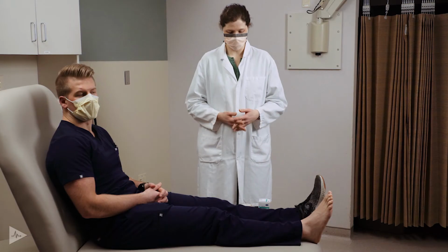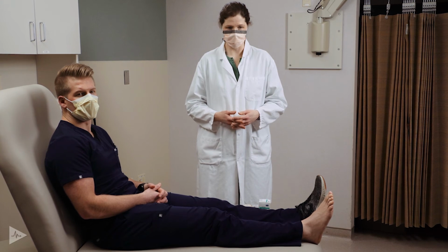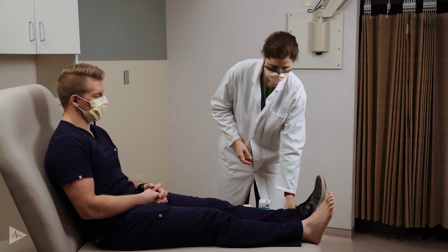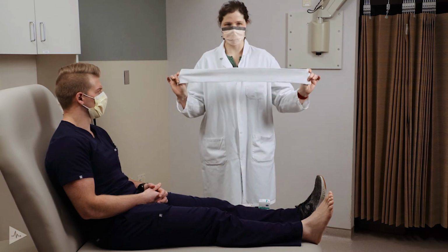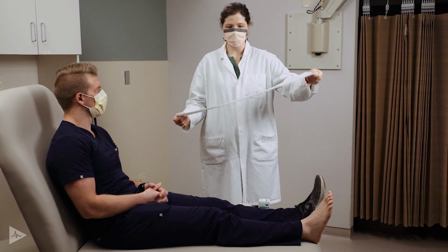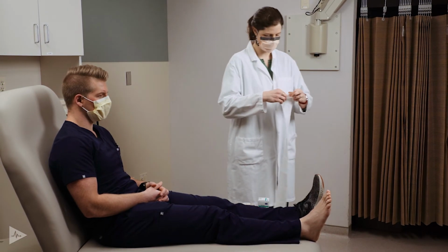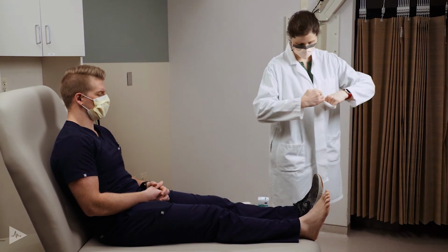And rubber gloves are also another good, cost-effective device to use just to provide a little bit more grip and traction on the stockings. And so now I will demonstrate how to apply the ACE compression wrap and then the low stretch system. And so we always start with some form of protective stocking to apply next to the patient's skin so we don't irritate and have any tissue breakdown because of the wraps.